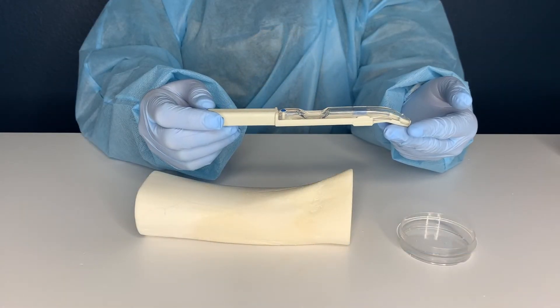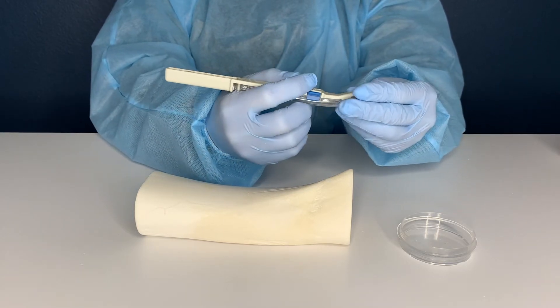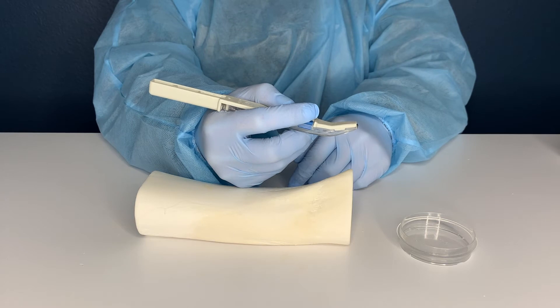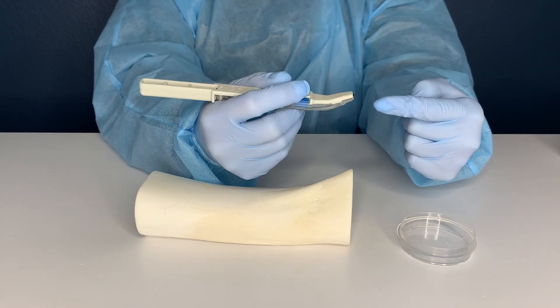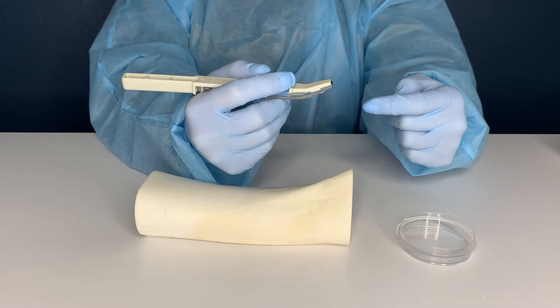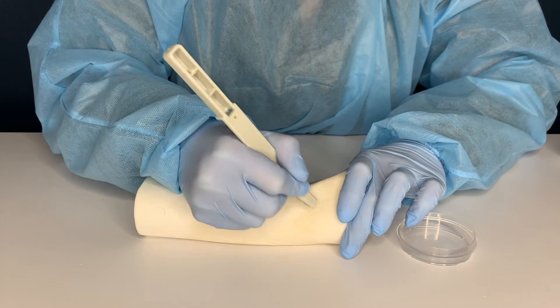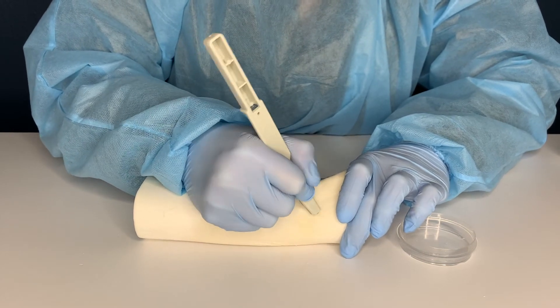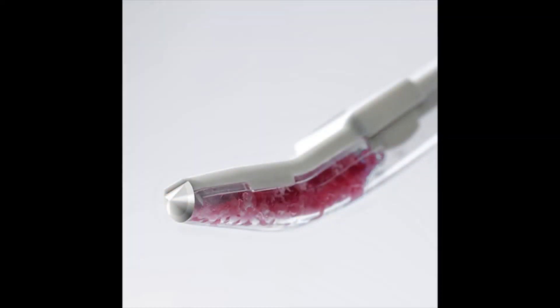To harvest bone using the Safe Scraper, hold the instrument with a pencil grip with the clear curved portion oriented towards the patient's bone. The cutting edge is located at the tip of the clear portion of the device. Place the cutting edge on the bone, apply pressure, and drag the blade across the surface of the bone. Repeat until the storage chamber is full or the desired amount of bone is gathered.